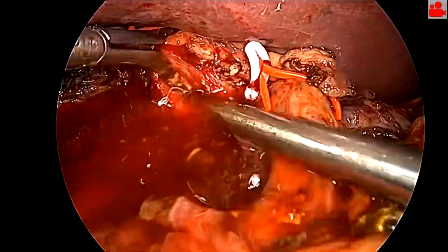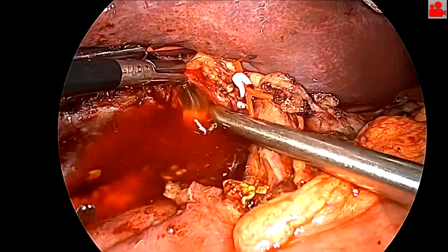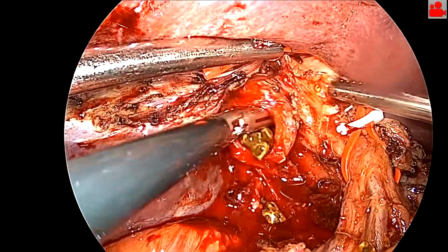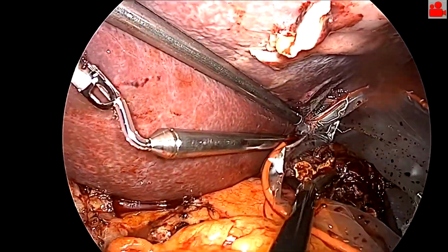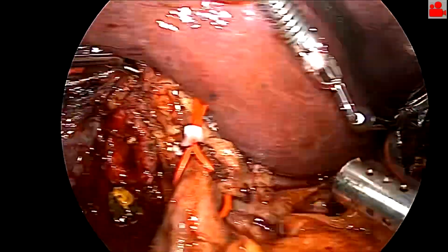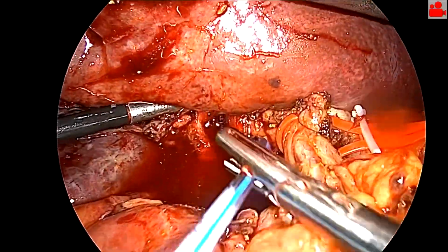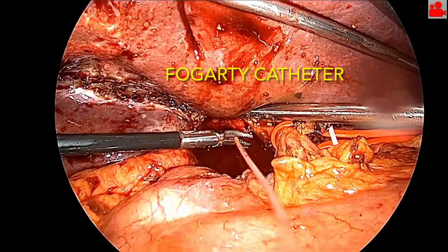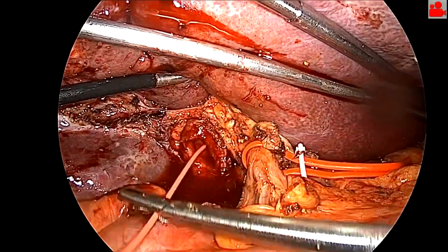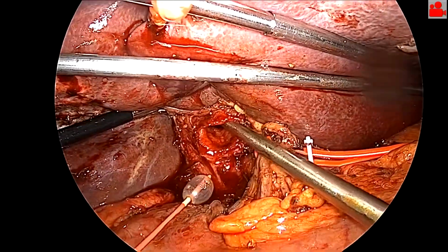Afterwards, we proceed to the bile duct exploration, the part that is considered the most challenging in the context of laparoscopic surgery, starting with a combination of manual evacuation and irrigation of relatively large stones, as you can see. Then we perform a deep irrigation using a feeding tube and attempts of evacuation with a Fogarty catheter.